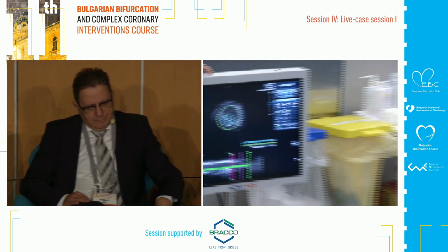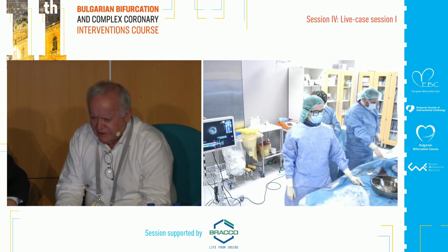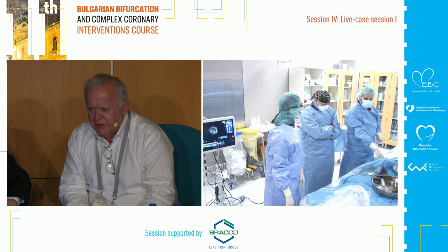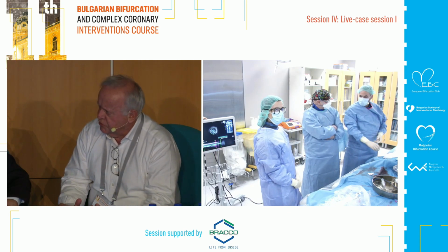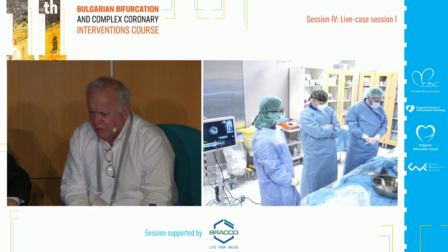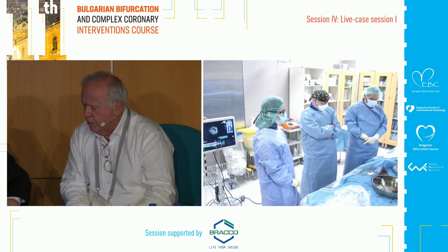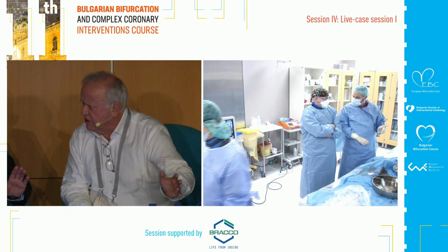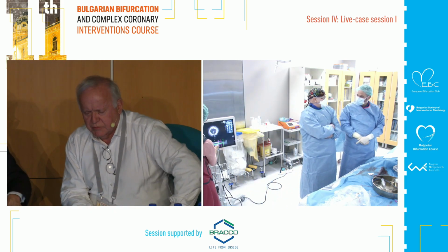Personally, I will use the classical technique of putting a wire in the aorta. Yes, you could do that. That was my next question. What do you think about the second wire? If you do this, you can put 8, in my opinion, safely. But putting 10 is not a problem. And personally, I think 12 is a good option.